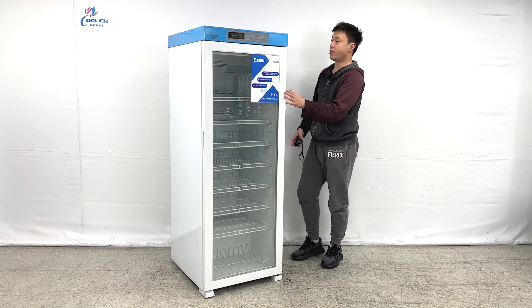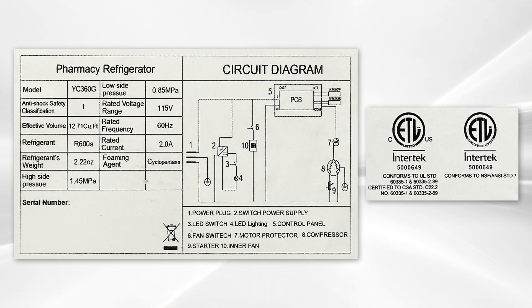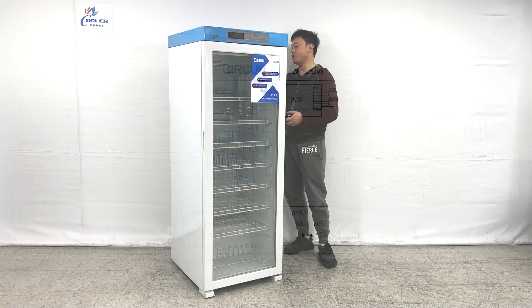After we close the door, we can look at the side of the unit. They do have ETL sanitation stickers, model number with serial numbers, and the cord and diagram information.